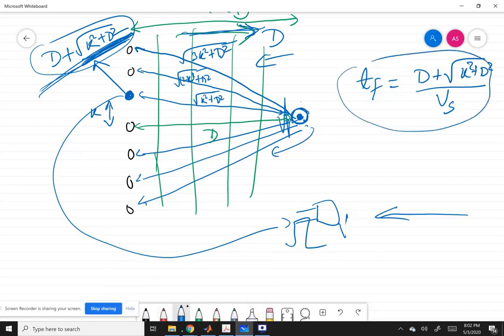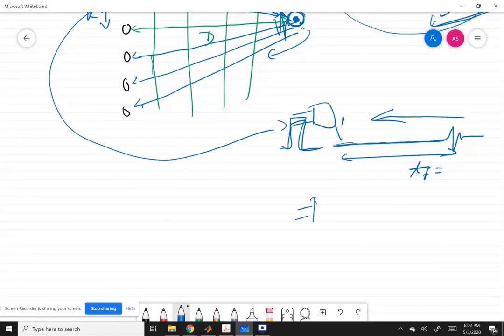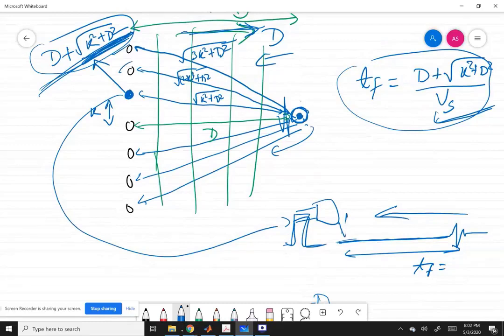So immediately after firing the transducer, we start sampling, and the sampling will give us the waveform which it receives from the point of observation at a certain time. This time of flight for this transducer will be given by this formula here, and it can be calculated for all these transducers. So every transducer will receive a signal from the point of observation.